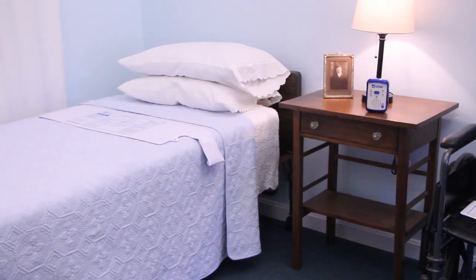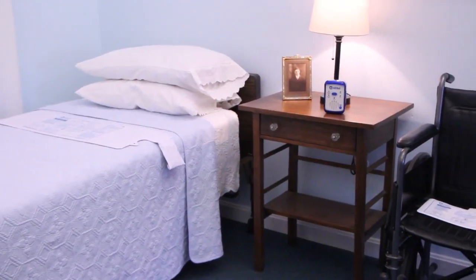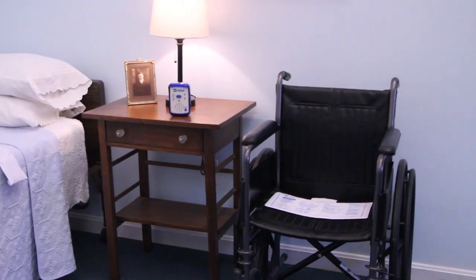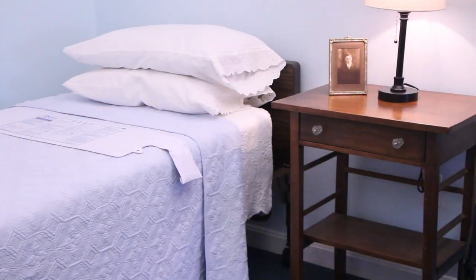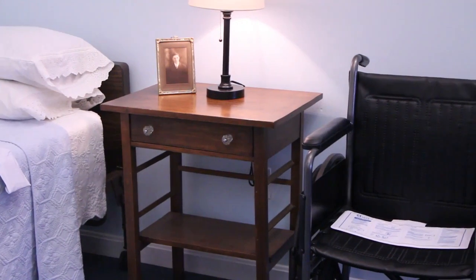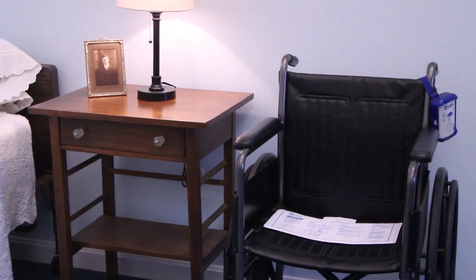Because the alarm can be mounted up to 30 feet away from the bedside, caregivers can be alerted without startling the patient. For added convenience and patient protection, two sensor pads can be simultaneously monitored with just one unit.